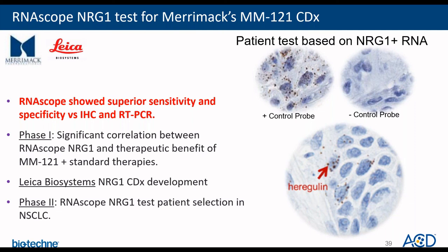And so finally, they partnered with Leica Biosystems and utilized RNAscope assay for combination diagnostic tests, for companion diagnostic test development and for the selection of patients in phase 2 clinical trial.